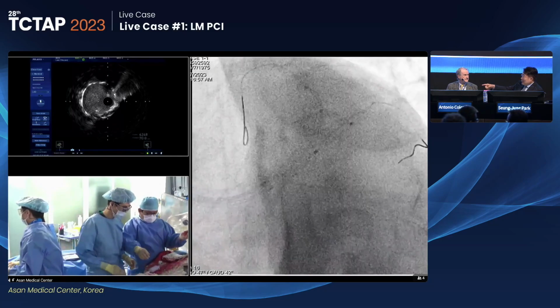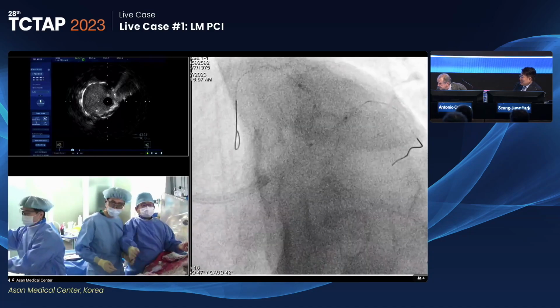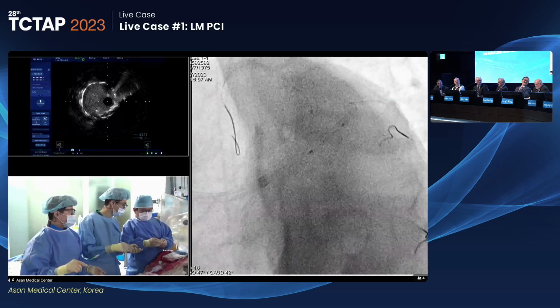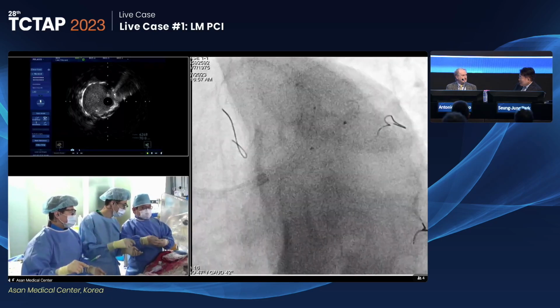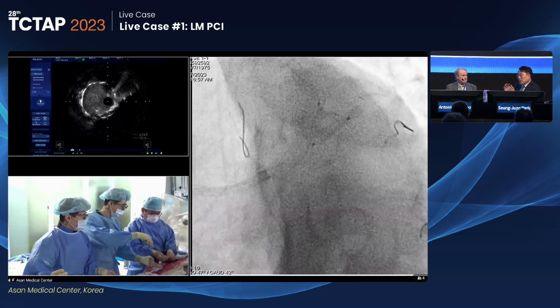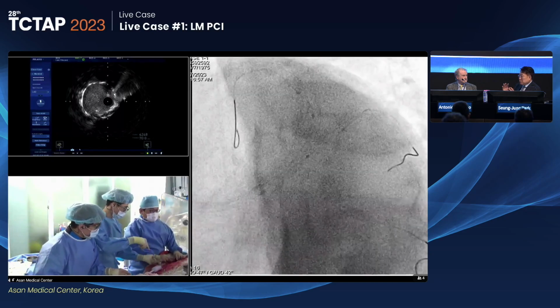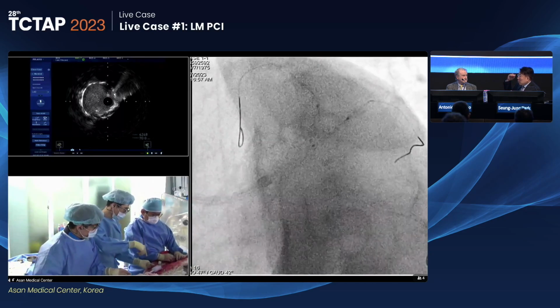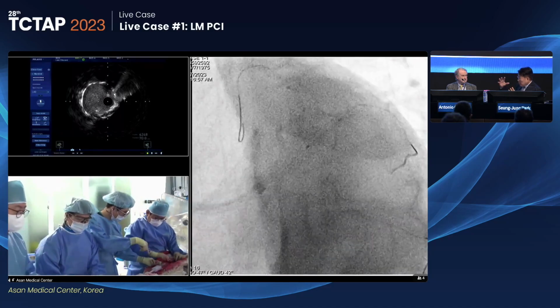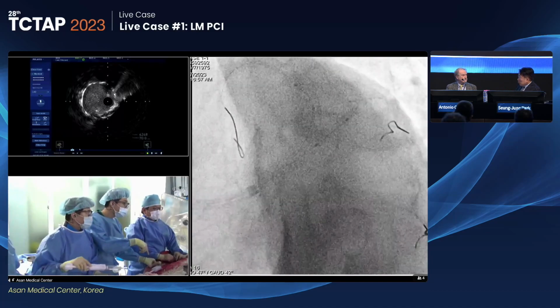David, what do you think? Small vessel, 2.5 or less. Any vessel that you dilate with a 2.5 balloon. What I'm talking about is a relatively small vessel. In a big vessel I have less concern, because it's a big vessel itself. So relatively small one, less than 3 or something.